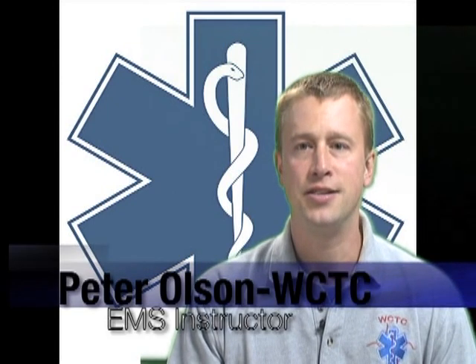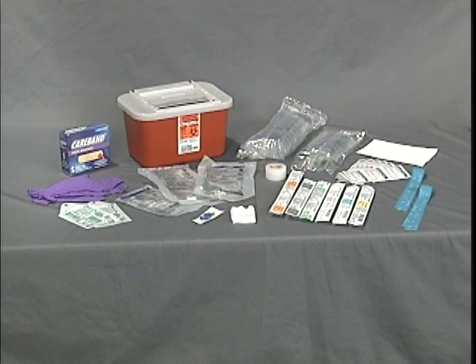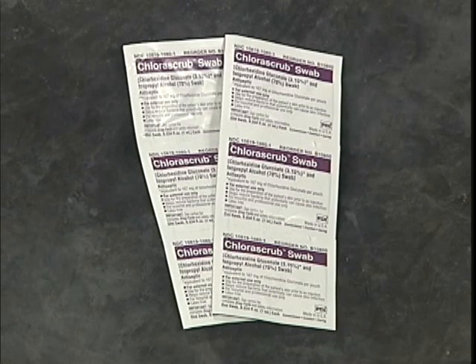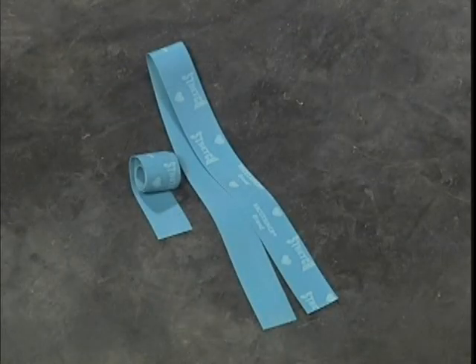IV access to a patient provides one of the most direct routes for treatment. Fluids and medications can be immediately introduced into the body through the circulatory system. Before you begin, prepare all necessary equipment: sharps container, tape or securing device, antiseptic swabs per your local protocol, gauze pads, sight dressings, a latex-free tourniquet, appropriate size catheters, and a bandage. Preparation in advance will help you achieve a safe and sterile intravenous catheterization.